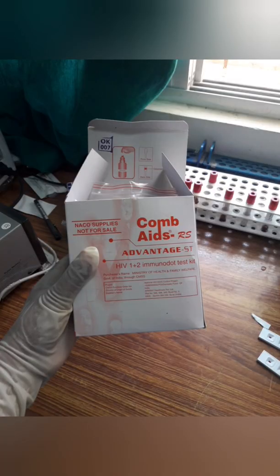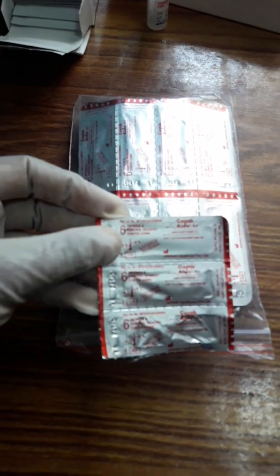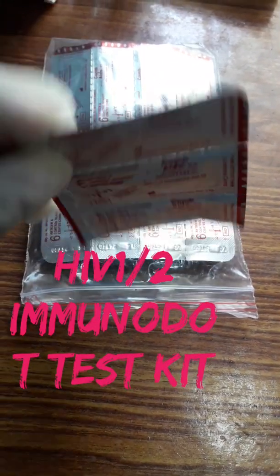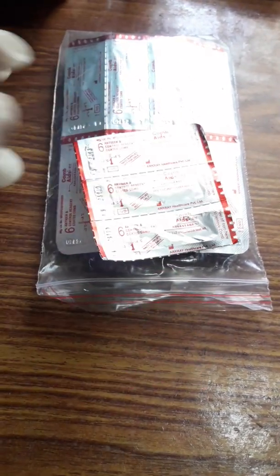Now look at this — this is like a stick. We have to write the patient's PID number on this stick. At the end, we can see the final result on the stick. So now I write the patient's PID number on the stick.